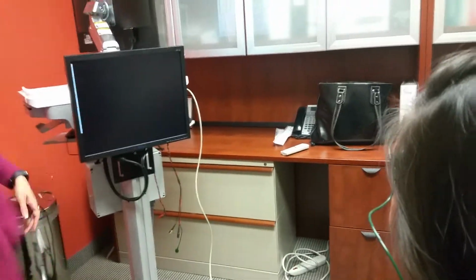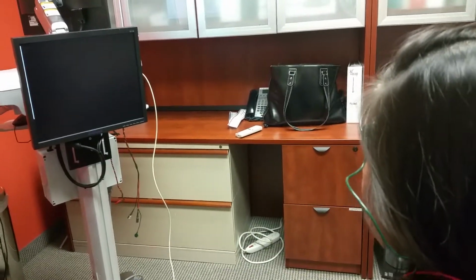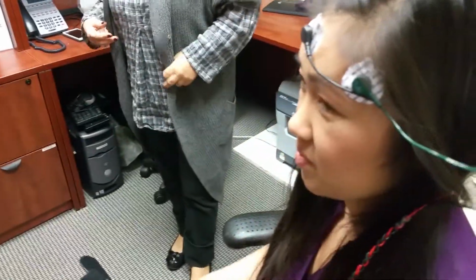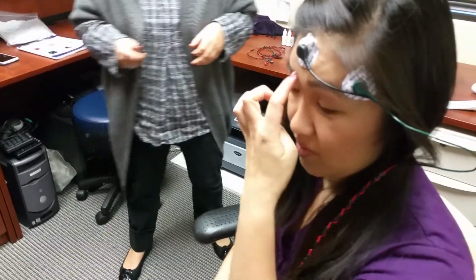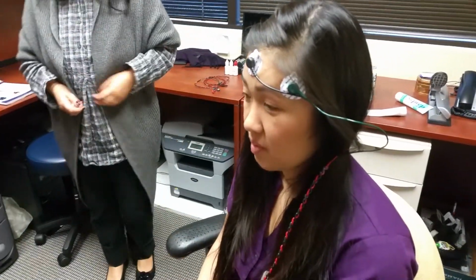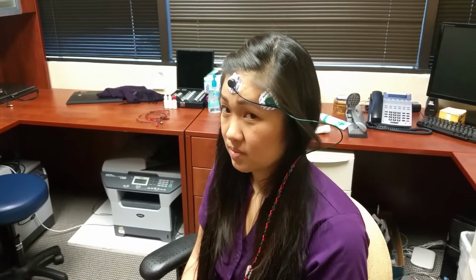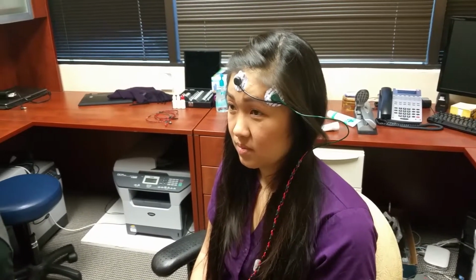Do you ever have problems with dry eyes? Do your eyes get dry? No, but our patients do. You guys can give them an artificial tear. That way, if it helps them kind of stay focused, that's fine too. Some of your patients also, whenever you put those little electrodes on, it's going to be a little uncomfortable and you'll see that they'll blink a lot, which causes you guys to have a lot of artifacts, which kind of tank your test results. You can give them a drop of proparacaine, if that helps.